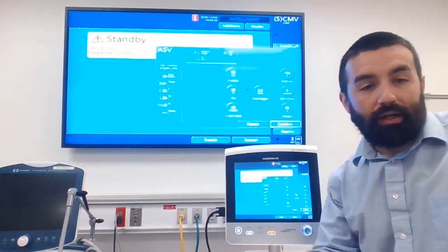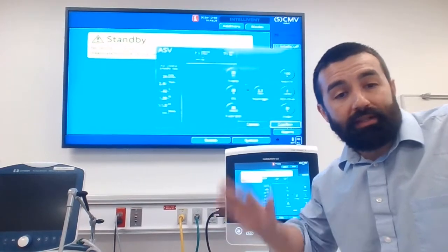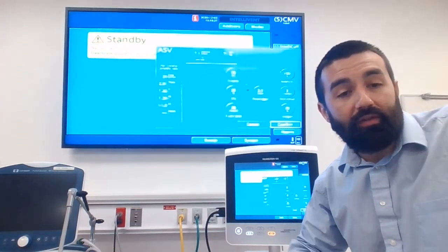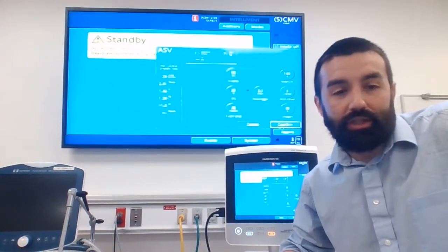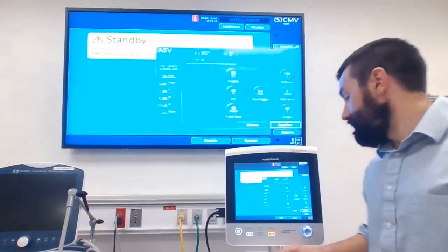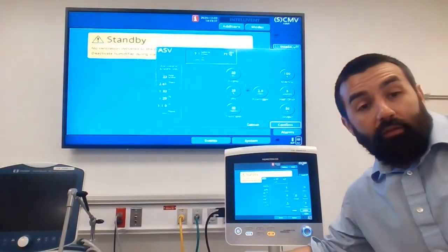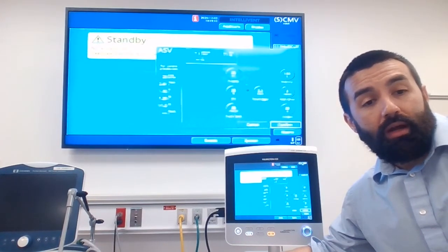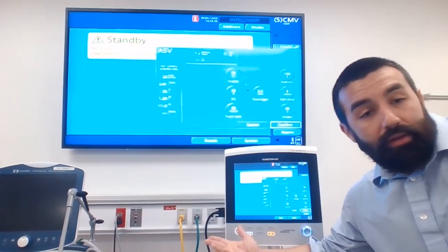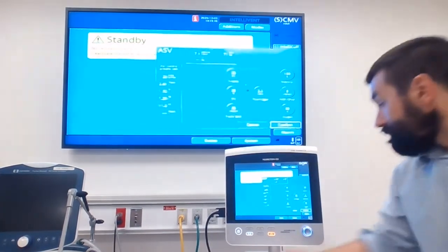So it's adjustable pressure support if you think about it like that. We pick a targeted tidal volume and it's going to adjust to make sure it's delivering that tidal volume up or down as the patient's demand changes, as the patient's lung characteristics change, and so on. So a patient can actively breathe comfortably and get spontaneous breaths. The only time the mandatory breaths kick in is if that patient is not achieving their targeted minute ventilation or if they're not breathing at all. Okay. So this is IMV.